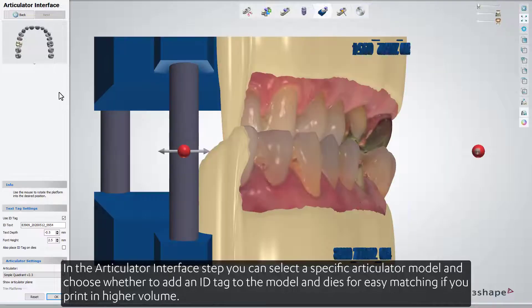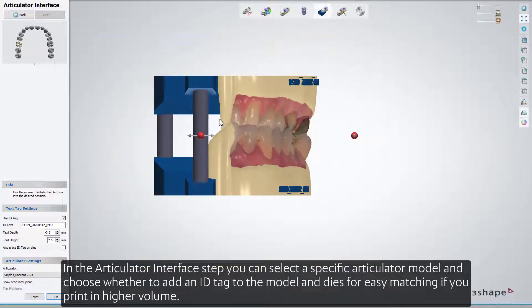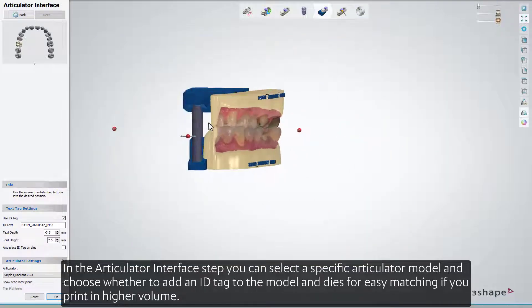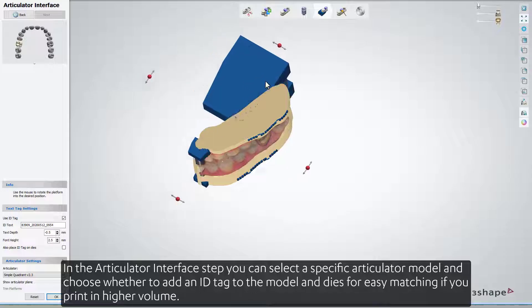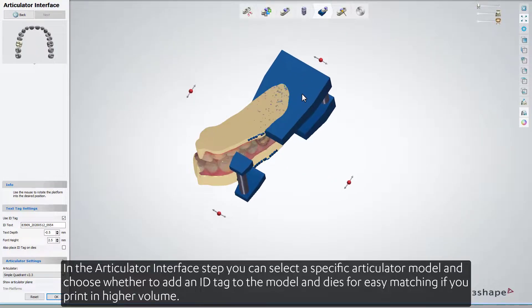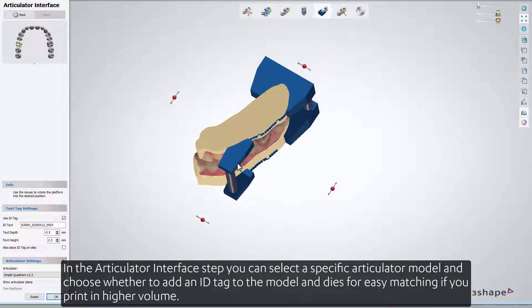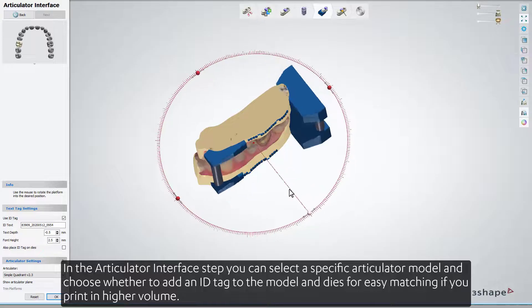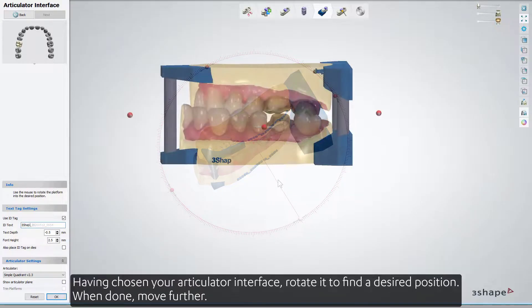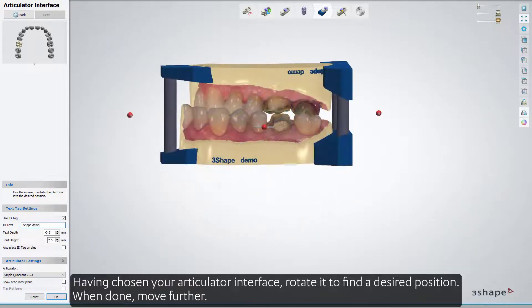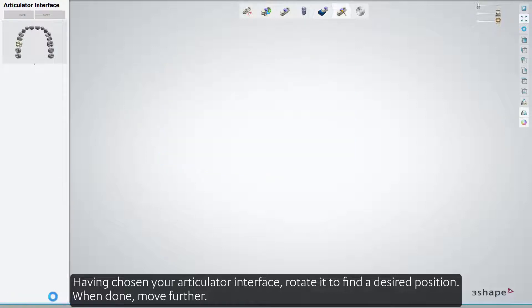In the Articulator Interface step, you can select a specific articulator model, and choose whether to add an ID tag to the model and dies for easy matching if you print in higher volumes. Having chosen your Articulator Interface, rotate it to find the desired position. When done, move further.